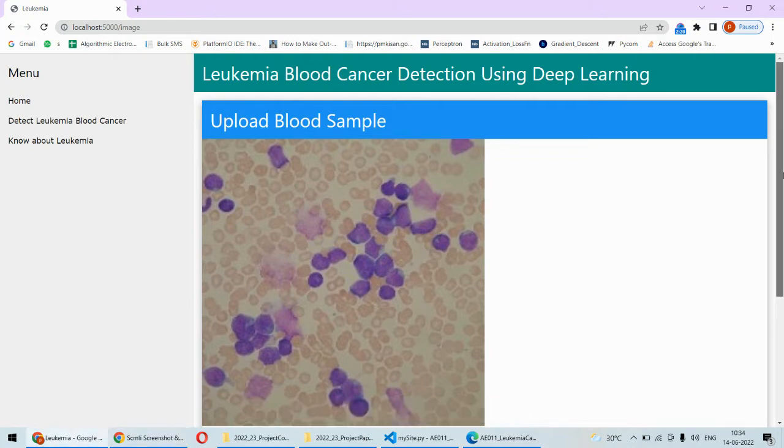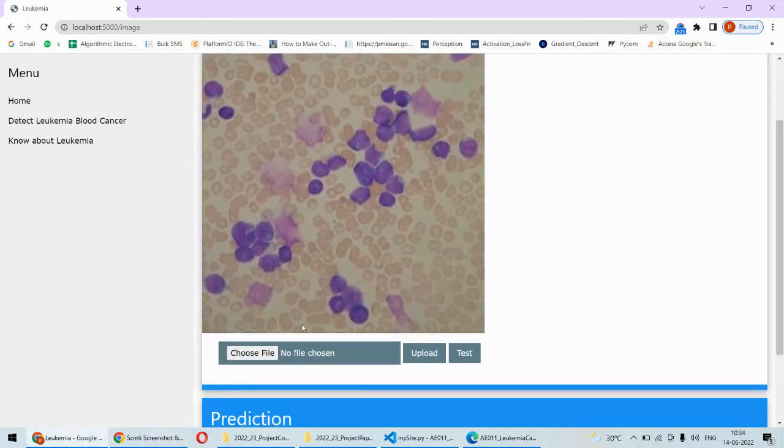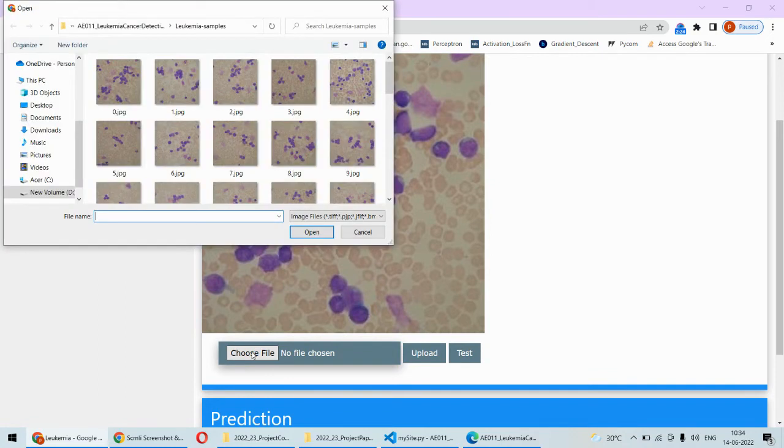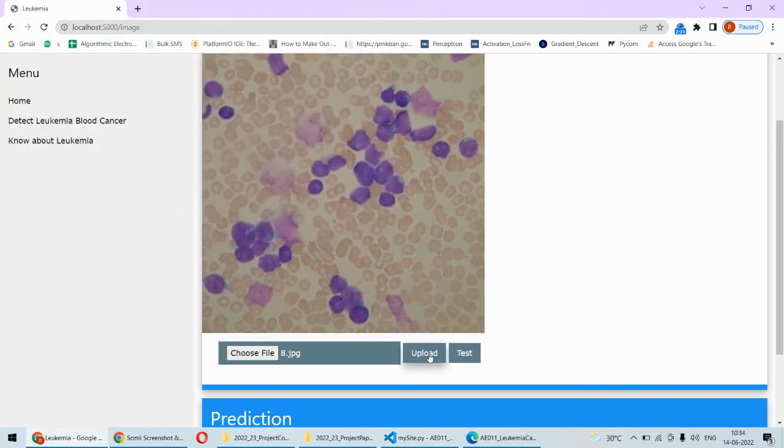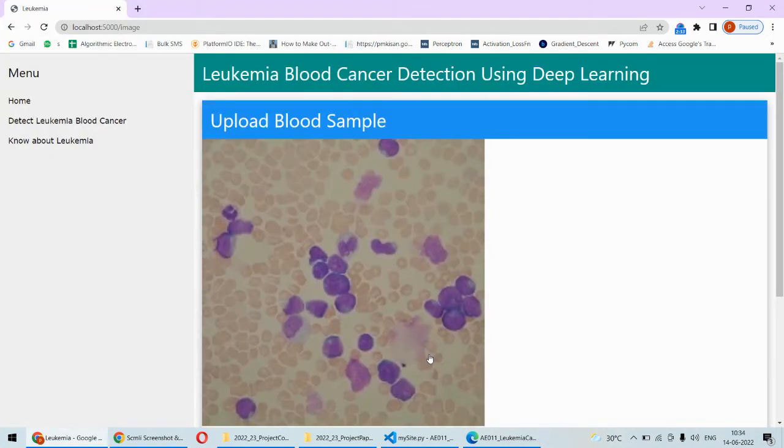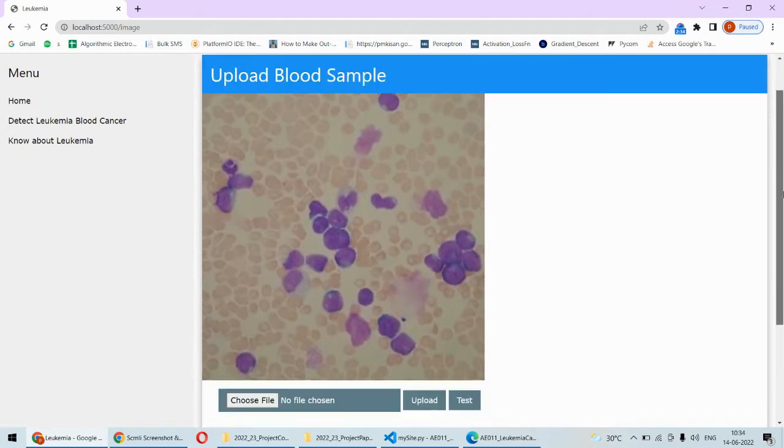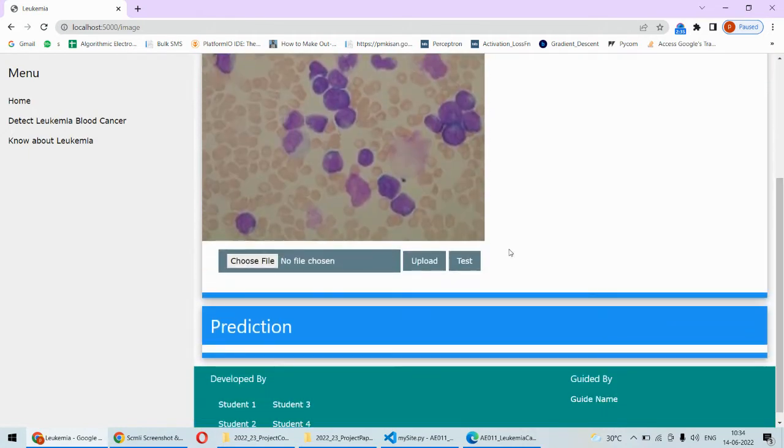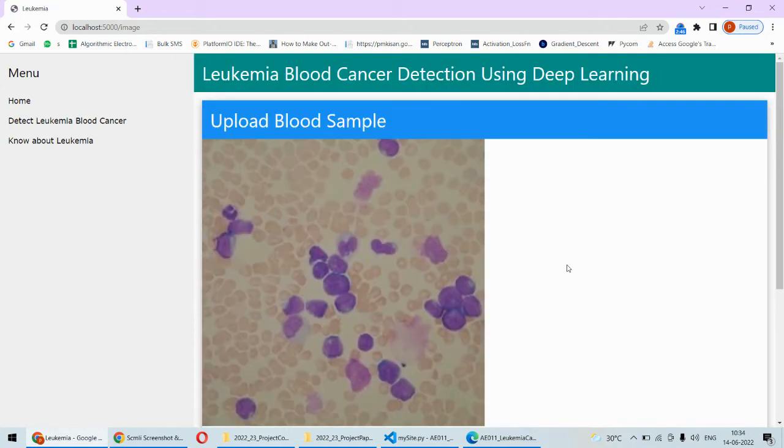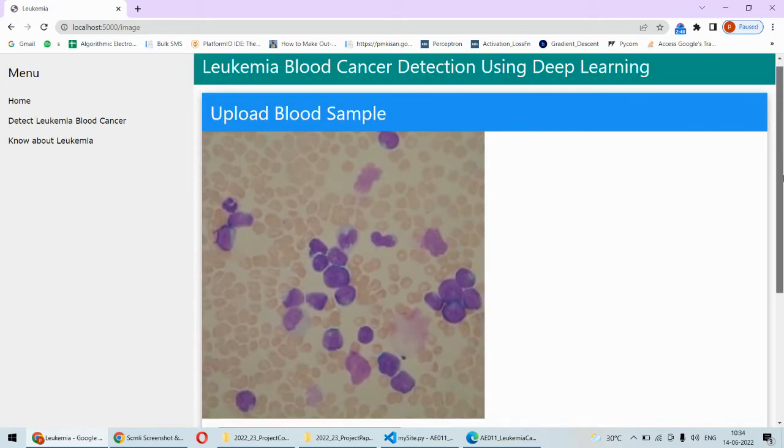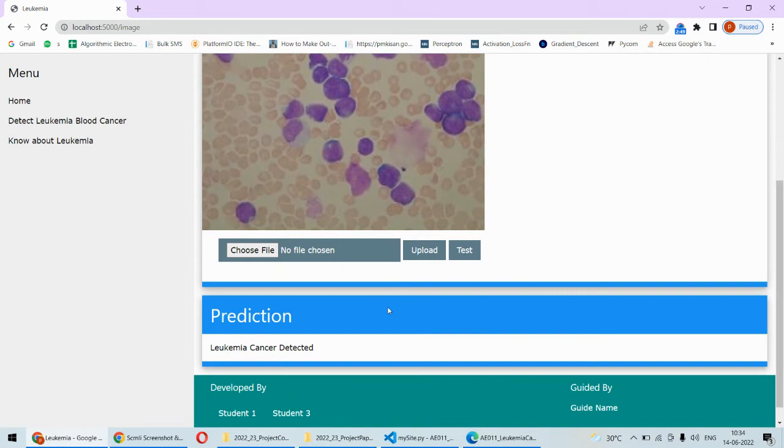For example, this is a leukemia sample. If I consider this image and upload this sample, then let's see what happens. After test, we will be getting the results in the prediction section. We are waiting for the results now. Okay, it has executed, and now this is detected as leukemia cancer.